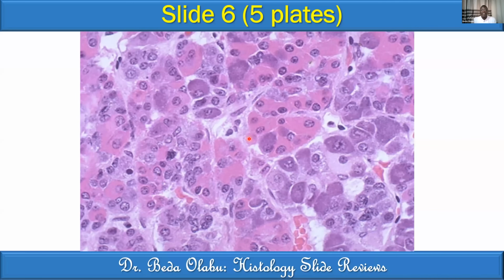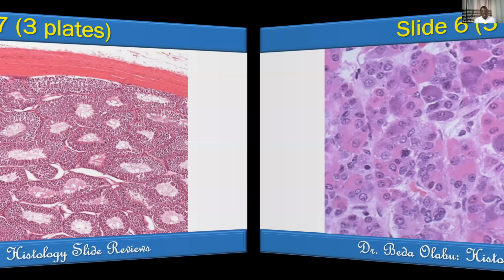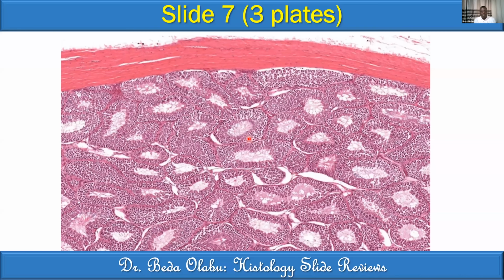Right? This is the next slide. So I'll take this. I have two slides to go. I'll take them up myself. I'll describe them for you. I hope you've learned how to describe.